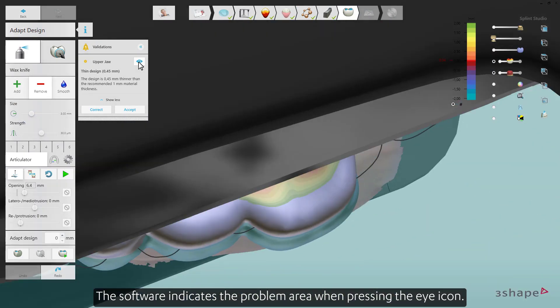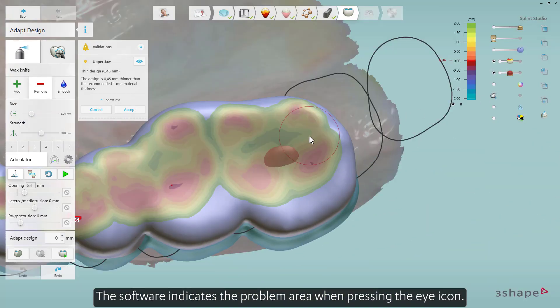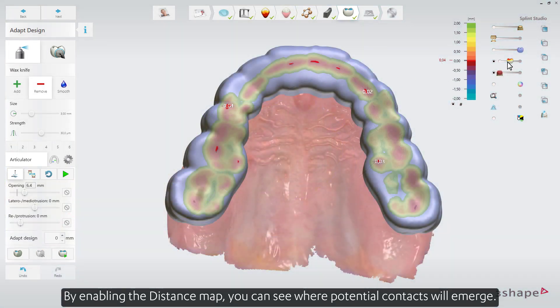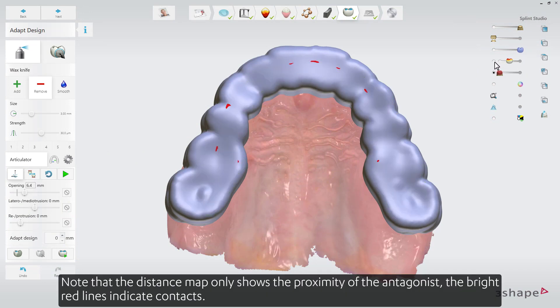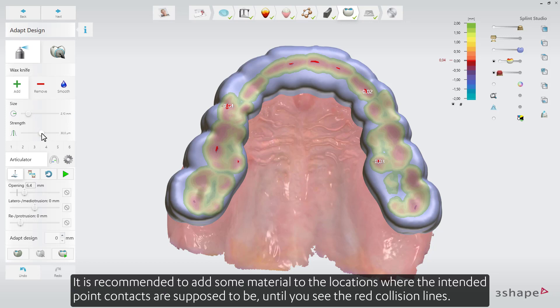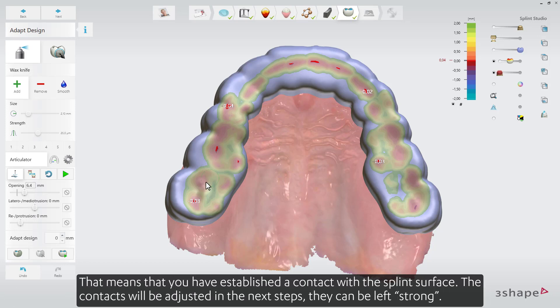The software indicates the problem area when pressing the eye icon. By enabling the distance map, you can see where potential contacts will emerge. Note that the distance map only shows the proximity of the antagonist. The bright red lines indicate contacts. It is recommended to add some material to the locations where the intended point contacts are supposed to be, until you see the red collision lines. That means you have established a contact with the splint surface.